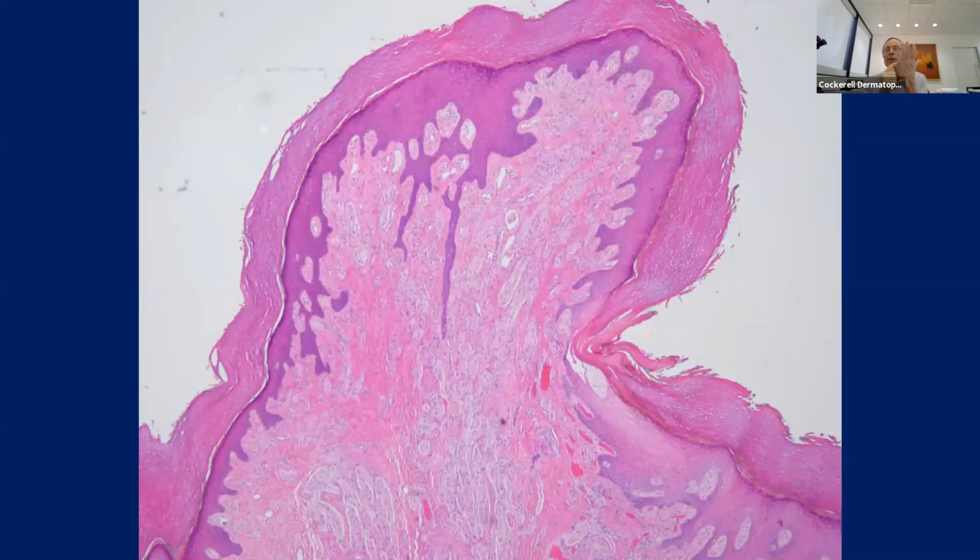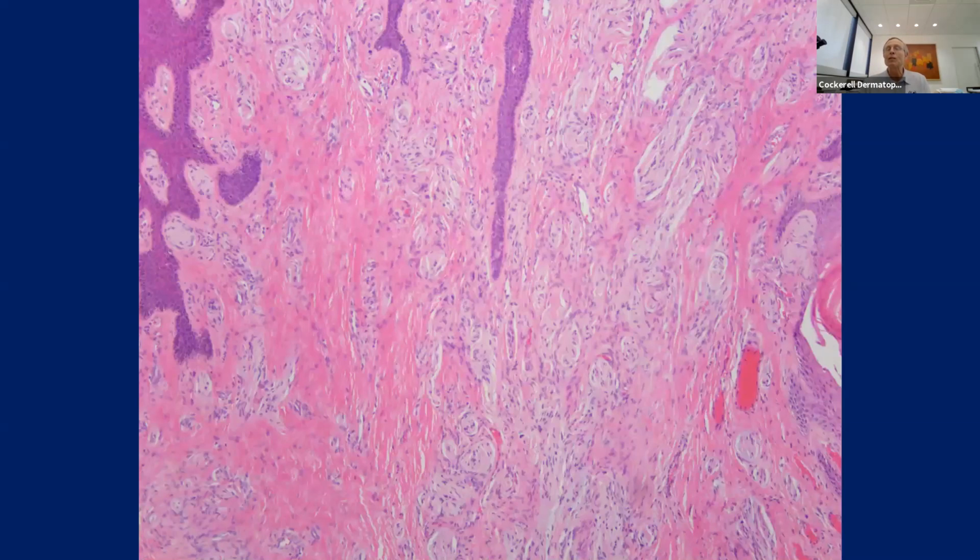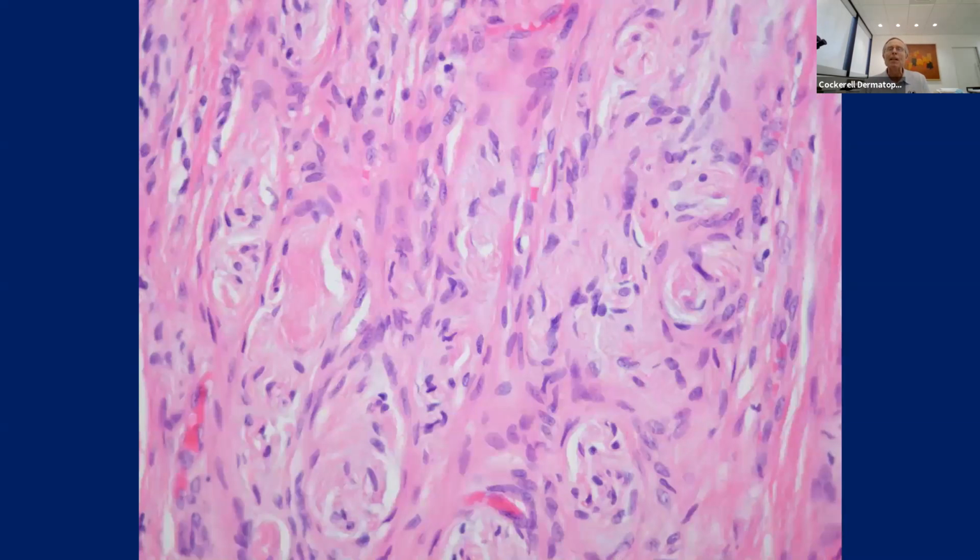They're often seen around the fingers in this area. I think there's a picture of that in a minute. And so what happens is these things get traumatized. They often get amputated in utero, and there's often a little nubbin that's left there, and somebody biopsied it and it looks like this. And it is really a form of a traumatic neuroma.